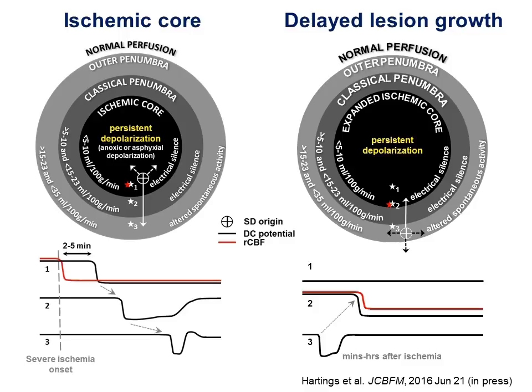There's no evidence really that this is specific to any frequency band. It should affect all frequencies. That's what the subdural recording data indicate. But it seems easiest to detect when there's a high amplitude delta activity background. And in fact, what we found was that there's commonly fluctuating high amplitude delta with periods that lack that, and it can go back and forth. And what we found is that, by and large, these fluctuations are explained by spreading depolarizations.